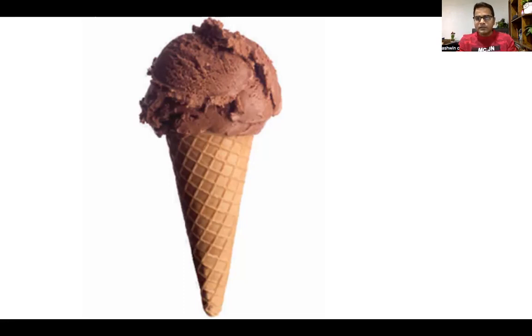Why am I telling you all these things in a funny way? Because when you try to enter the canal, you will find all these hindrances blocking your file. So when you start your preparation, you have to remove those interferences in the first go. That means you have to prepare the coronal part first. That means you have to eat that chunk of ice cream first. The moment this is out, a lot of interferences are out. Your maximum pulp is out. So your file will find less resistance to go in. And that is what we require.